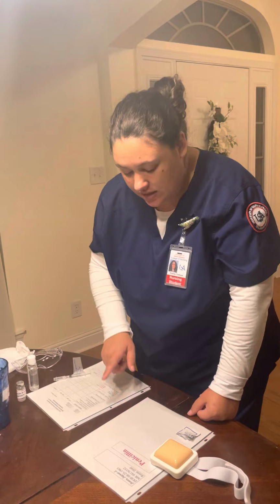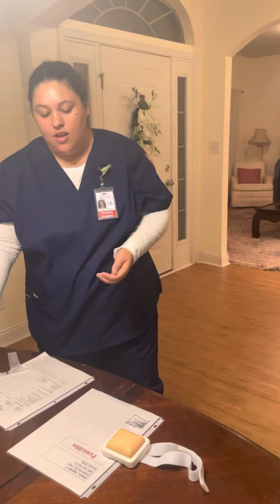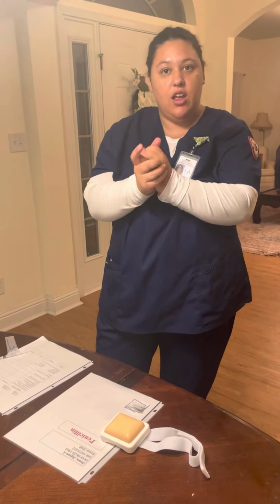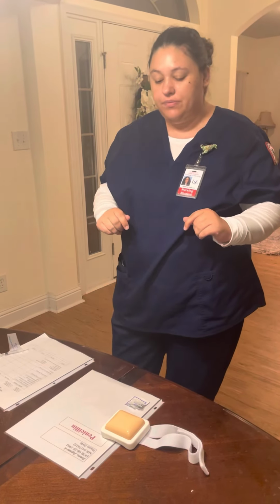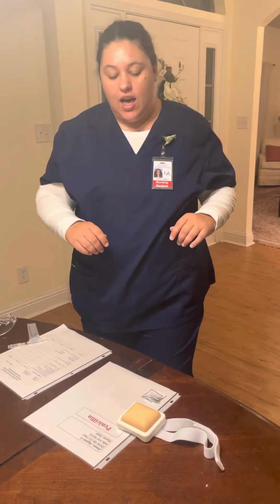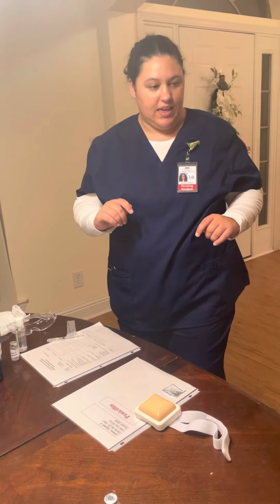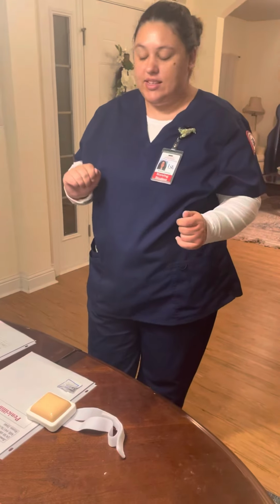Allergies is penicillin. Mr. Jones, I see that you're allergic to penicillin. Is there any other allergies you would like to tell me about today? No? Okay, Mr. Jones, I am going to take your blood sugar level before I administer you anything, just to make sure you're in the safe range. Good, you're in the safe range.